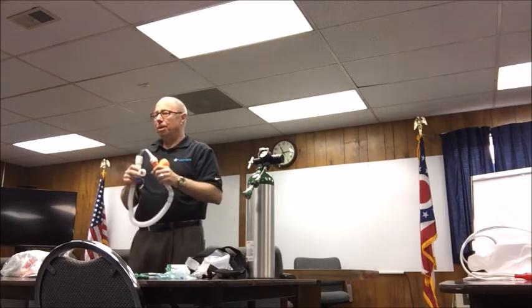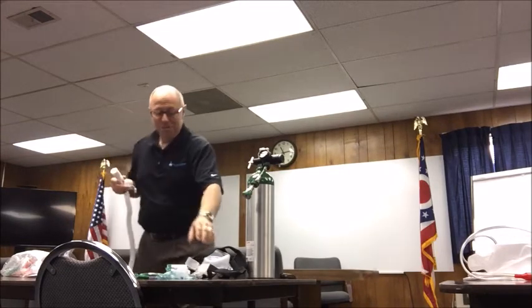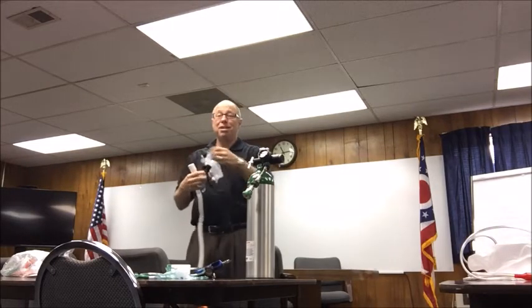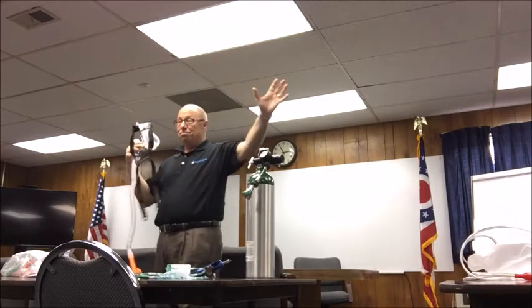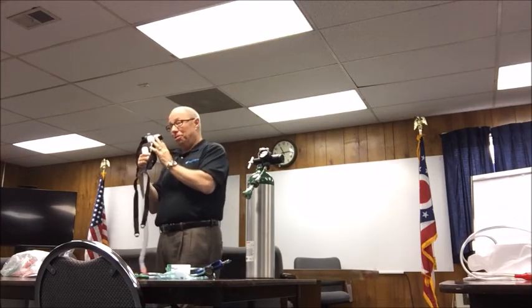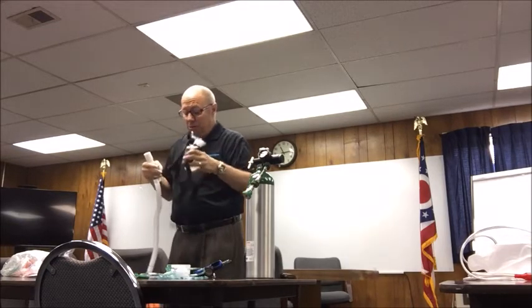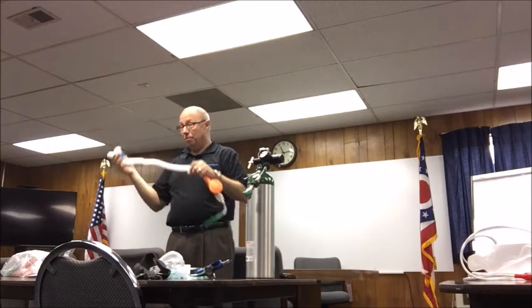I lost my waveform. What happened? Did it get closed? No. Close. Is the mask too tight? Mask is leaking. You have a leak in the mask, and you're getting all that air washing out. So you can use it as a diagnostic tool for a good seal. Okay. I'm glad you're using capnography, because this and capnography are game changers.